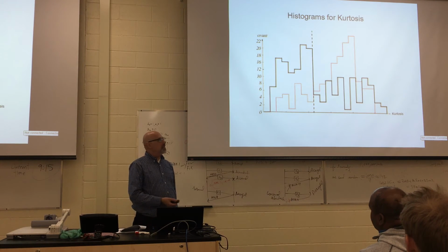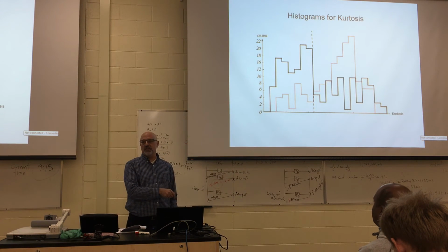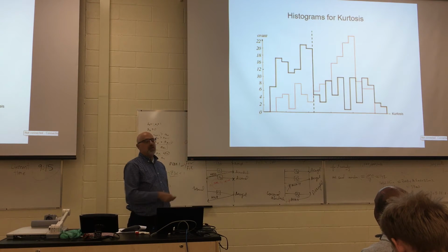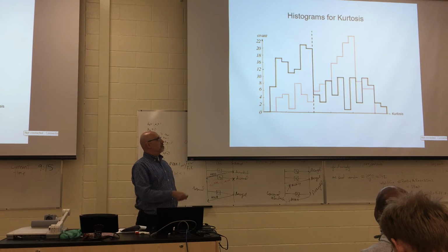The way of estimating that is: if our prediction is that anything to the right of this line is contaminated signal, yet we're seeing clean signal, we take all of the counts of clean signal that were misclassified, the errors, and divide that by the count of the ones that were correctly classified. That is your classification error for clean signal. And similarly, everything to the right of that line, we're classifying as contaminated signal.